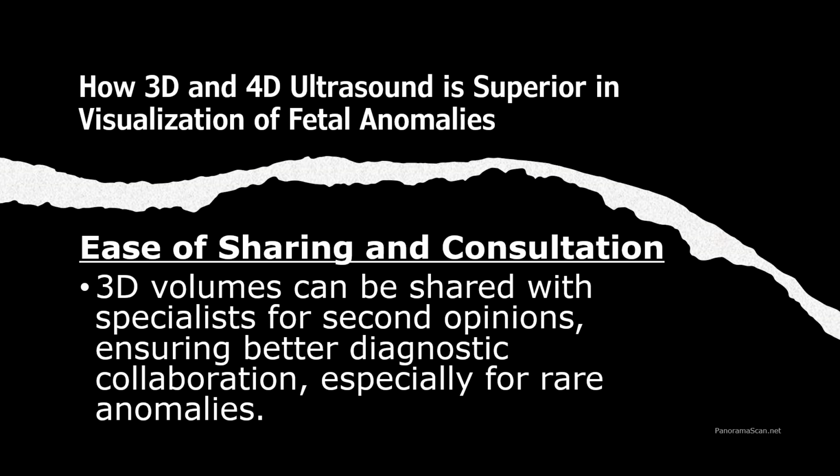Experts from around the world can access and review the 3D imaging, providing valuable insights that help inform management and treatment plans. By enhancing collaboration, these technologies not only improve diagnostic accuracy, but also contribute to better, more personalized care for the fetus.